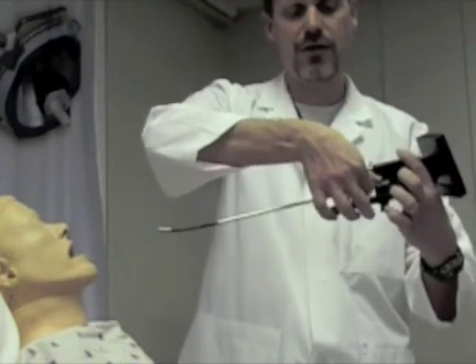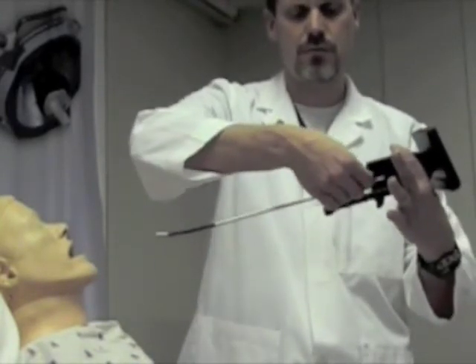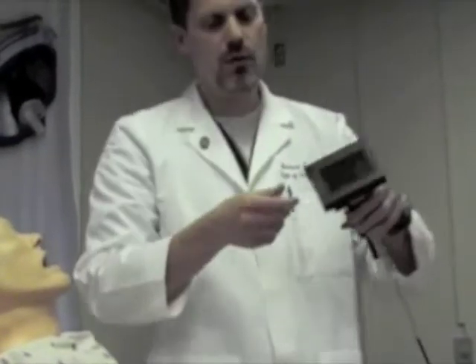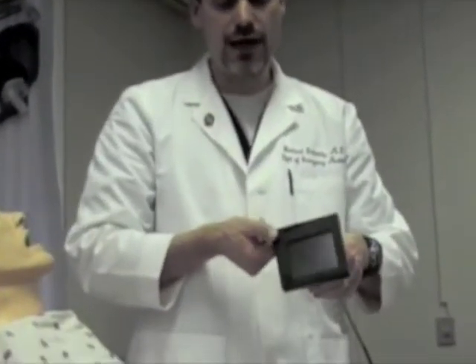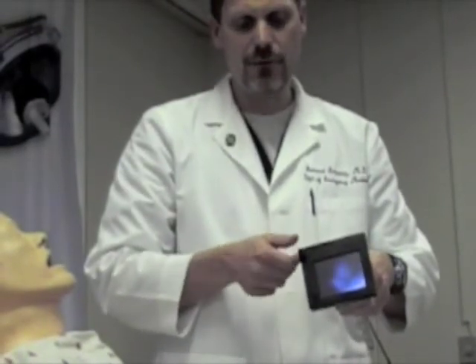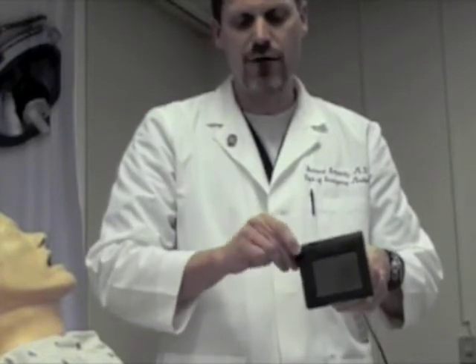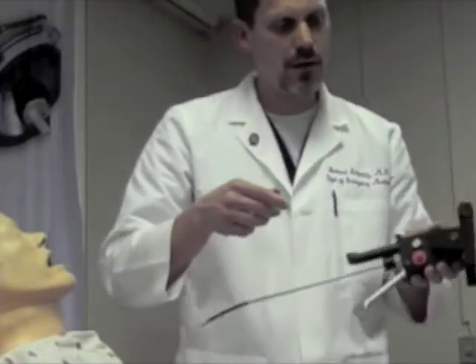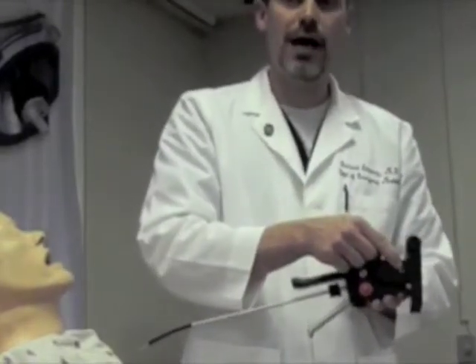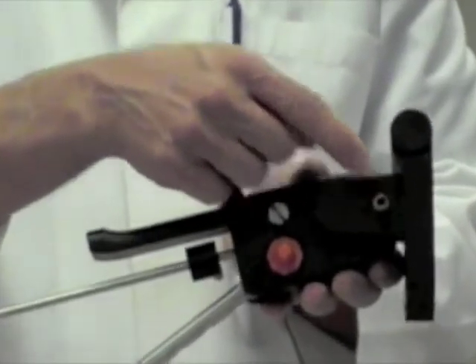Additionally, we have our tube stop with adjustment screw, and we have our battery cover and on-off switch. The on-off switch is activated by turning the cap in a clockwise motion, and it is turned off by turning it in a counter-clockwise motion. We have an RCA port out, which is compatible with a composite video cable.